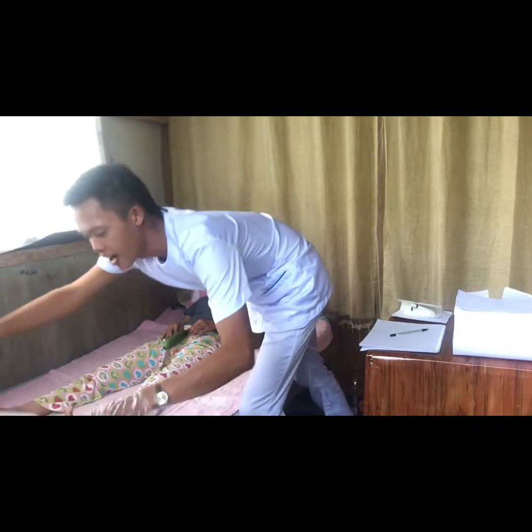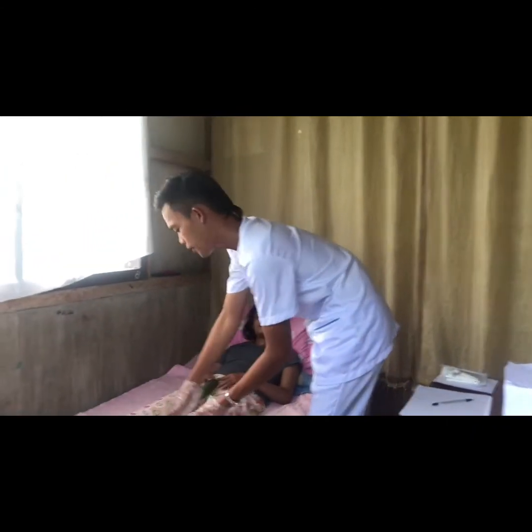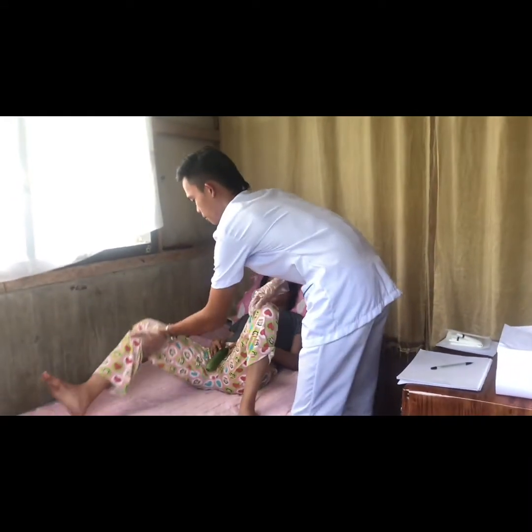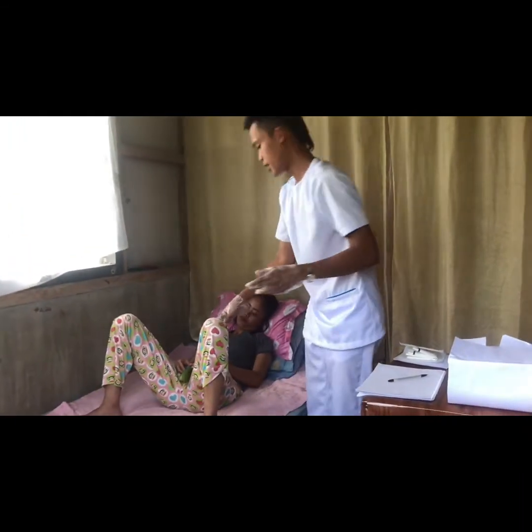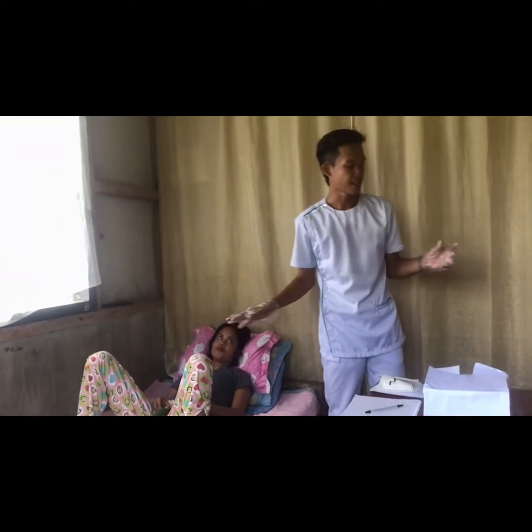Okay, so the private part of the patient is now exposed. So please, sir, help me. I'm going to set apart your feet. Okay. So for this time, the private parts of the patient is now exposed.